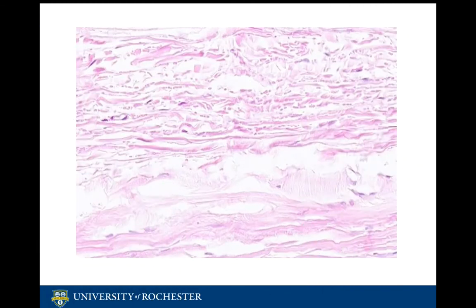Tracheal cartilage. The tracheal or hyaline cartilage is the next layer. It is a strong but flexible layer of tissue, which is used to support the trachea while still allowing it to flex, so that air can flow into the lungs. Hyaline cartilage is also resistant to external stresses.